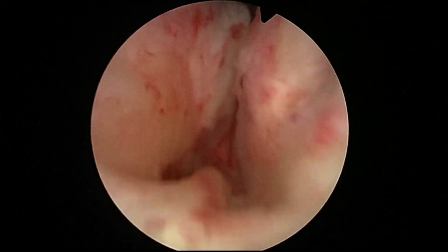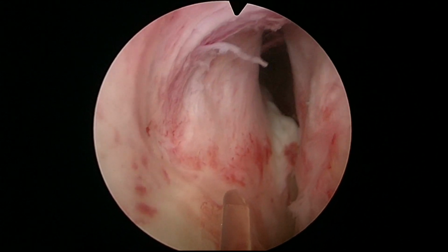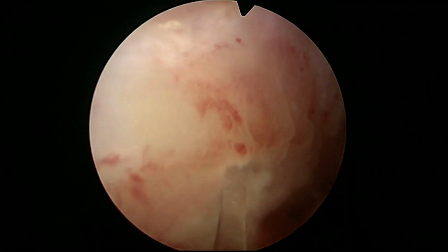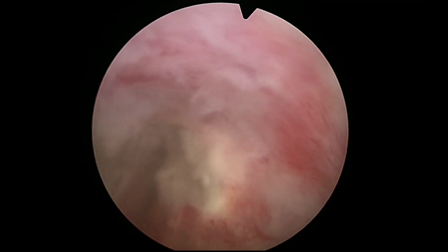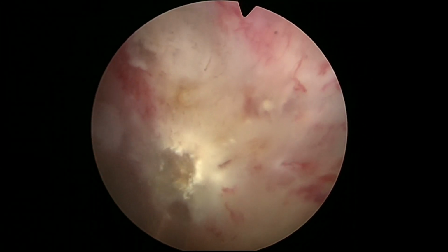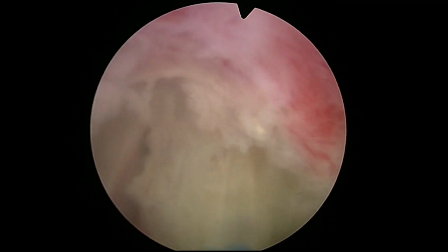It's quite interesting that one tends to think that these patients, if you do a minimal deobstruction, will do well. So often at the beginning, I would try to take out the middle lobe and things like this. Also, considering that sometimes prostate cancer can invade the sphincter, can affect sphincter function, and there is possibly a slightly higher risk of incontinence after an endoscopic procedure to deobstruct these patients. But it was very interesting that when we did that, we would see these patients coming back again with the catheter, and so I started to think, why not do a proper enucleation in these patients?